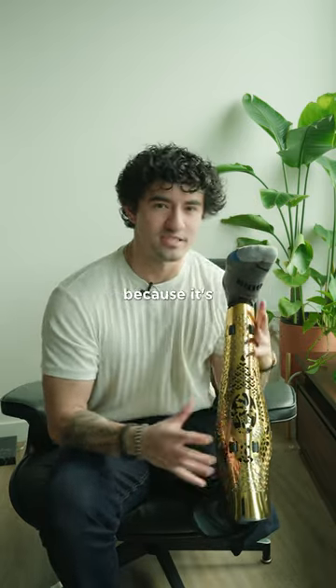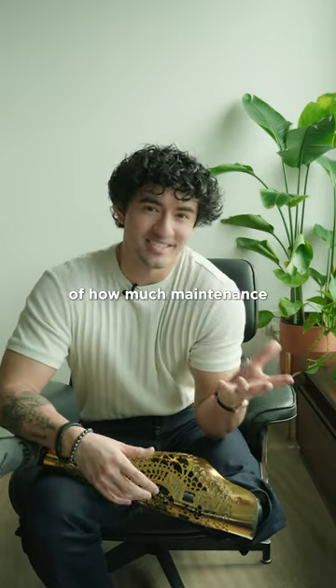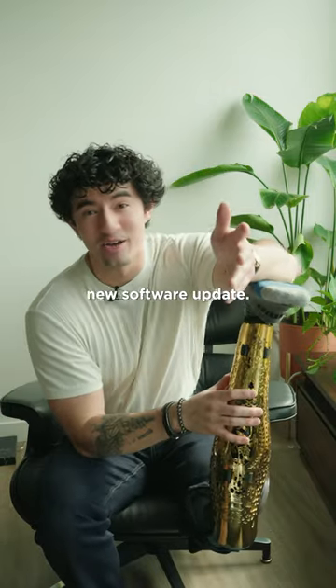With this prosthetic, so much needs to be fine-tuned because it's battery powered and there's a microprocessor in it, so I'm not surprised by how much maintenance it needs. But it's just something I never thought I'd have to do — ship my leg out and be on a rental leg — all so I could get my new software update.